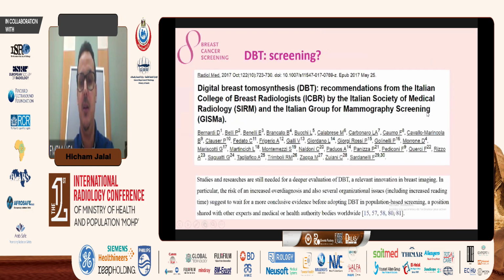Then this paper, published in 2017 concerning the role of DBT in the screening, is an Italian paper that shows that studies are still needed for deeper evaluation, and it suggests waiting for more conclusive evidence. And we will see that the American school is totally different from the European, not all European schools, but here with the Italian school.